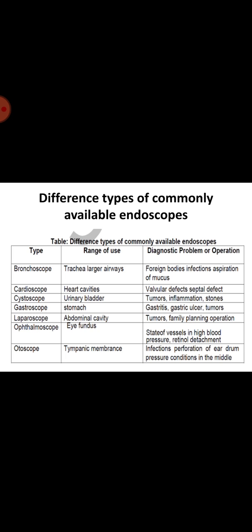There are 3 main reasons for carrying out an endoscopy. The first is investigation. If an individual is experiencing vomiting, abdominal pain, breathing disorders, stomach ulcers, difficulty swallowing, or gastrointestinal bleeding, for example, an endoscope can be used to search for a cause. The second is confirmation of diagnosis, that is, endoscopy can be used to carry out a biopsy to confirm a diagnosis of cancer or other diseases.